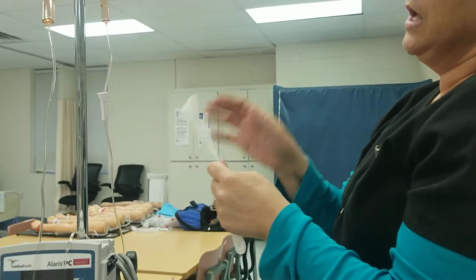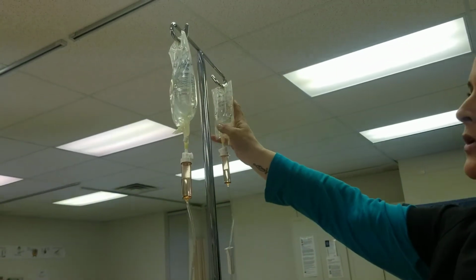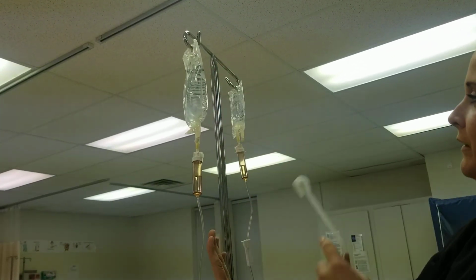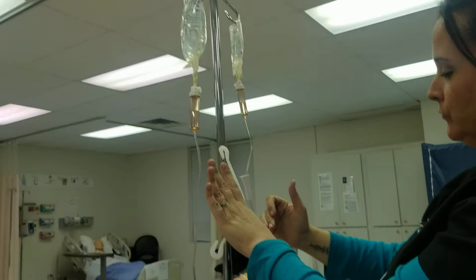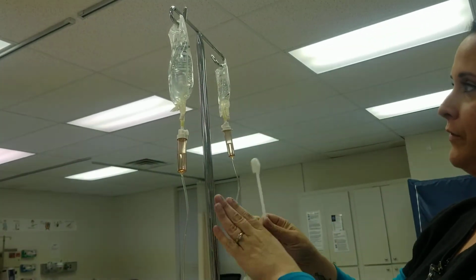So there's our secondary. This right here, you got to remember, so this is our primary bag. Right now, we're wanting to infuse our medication in our secondary bag. For this to take place, this bag has to be lower than this bag because gravity is going to pull from this. Once this runs out, it's going to automatically switch over to this bag and continue infusing.